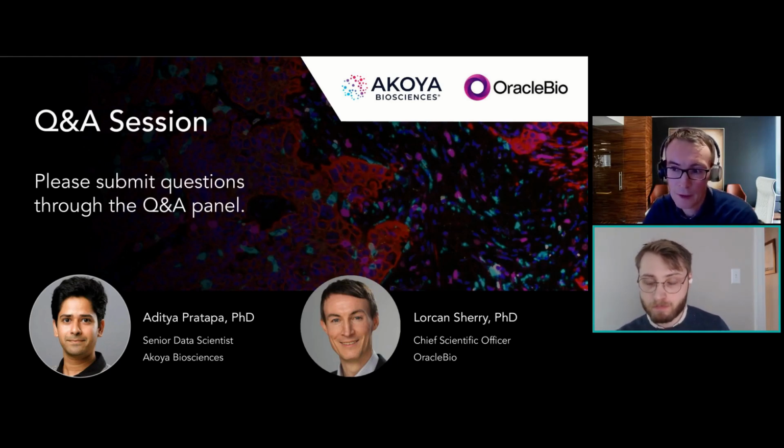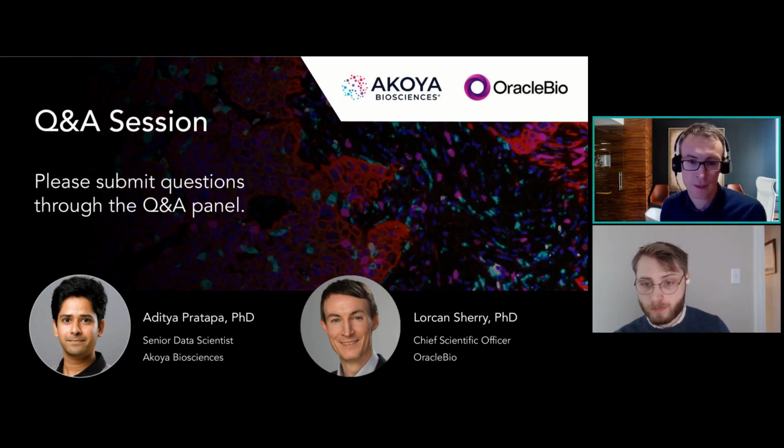Yeah, I think the area of multiplex IF has really allowed us to much better profile the underlying biology of disease processes and therapeutic responses. If I go back 10 years ago, we were dealing with single chromogenic stains and single cell populations and trying to determine mechanistic responses and biomarkers around a single cell count readout. Now we're able to look at all the different phenotypic profiles in cancers, and this is especially important in immunotherapy, which is one of the key areas for cancer therapeutics at the moment.